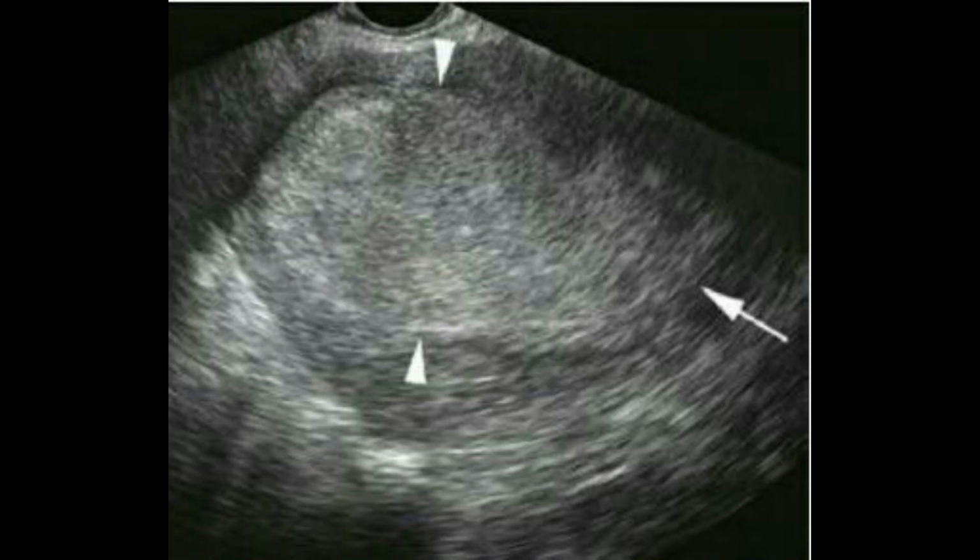Now, here you can see that the endometrium is thickened and irregular in shape. There is fluid in the endometrial cavity, and there appear to be multiple lobule-like structures projecting into the endometrial cavity. This is a case of endometrial CA. Here is another case of endometrial CA. It's a postmenopausal woman, and you can see that the endometrium is markedly thickened, and especially along the posterior wall, the endometrium-myometrial interface is not clear.